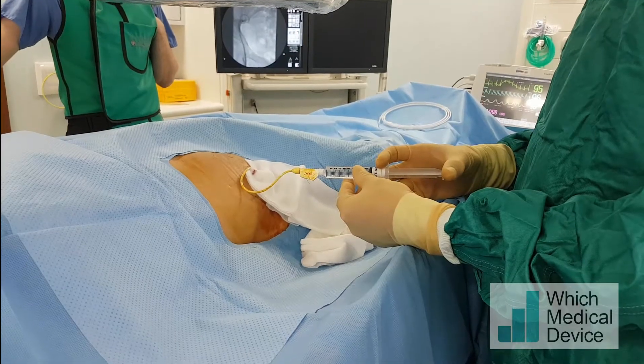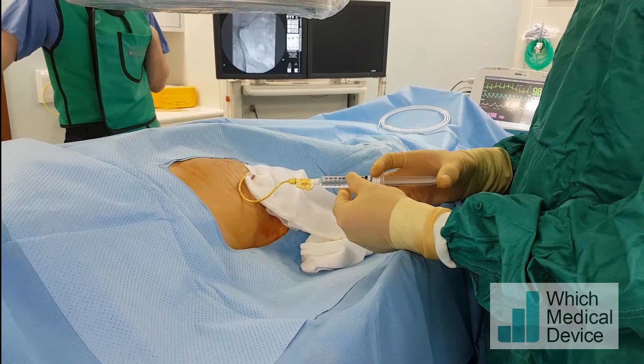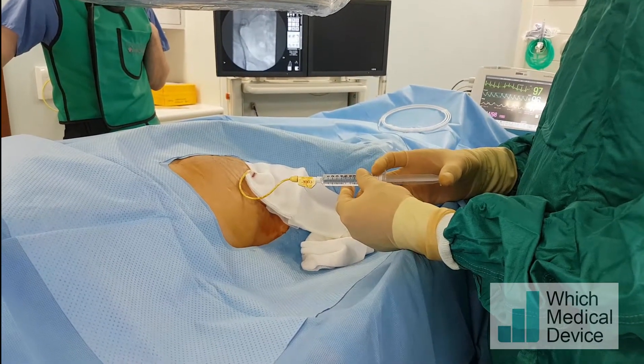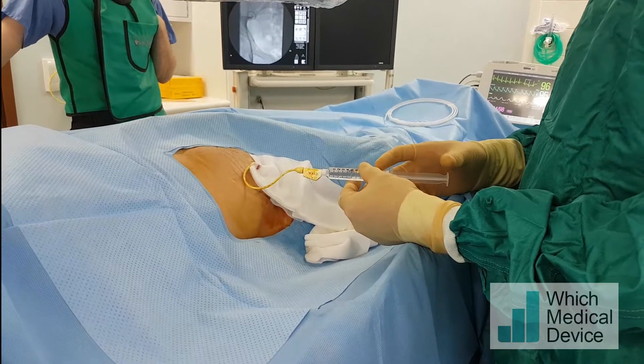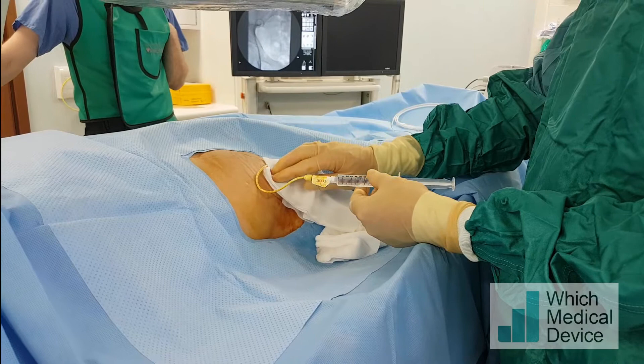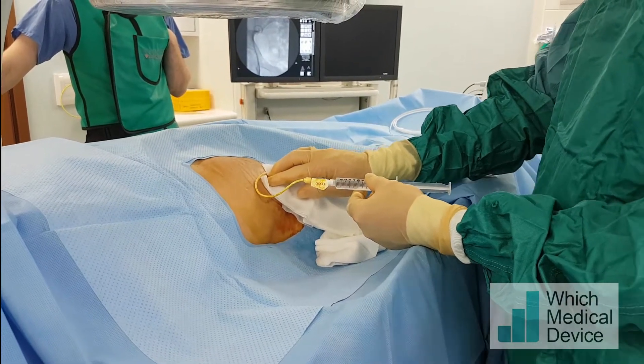This gentleman has got a transplant in his right iliac fossa and he's got a tight ureteric stricture which we've already tried once to cross with an 018 hydrophilic wire unsuccessfully. So we've left the transplant to decompress for a week with an external nephrostomy in situ. Now we're going to opacify the system and have a second go at getting through the stricture.